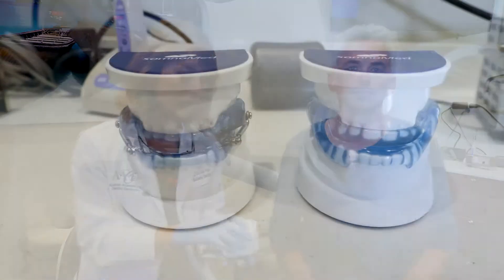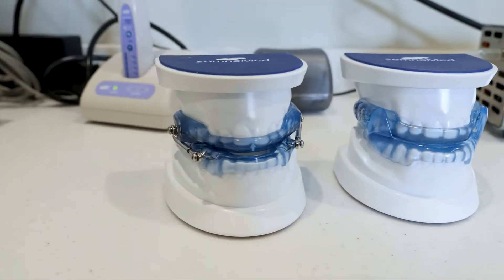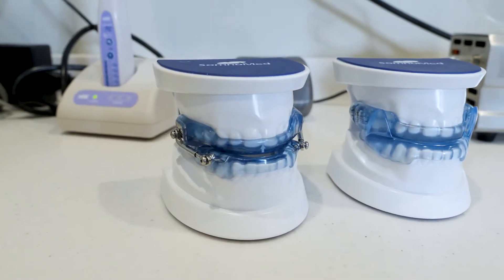I'm back with Brian. I just want a little live patient segment to show you what some of the appliances look like. We will have some photos you can zoom in on, but essentially the appliance fits over the top and bottom arch and it's going to hold your lower jaw slightly forward so that your tongue won't fall back when you're sleeping.